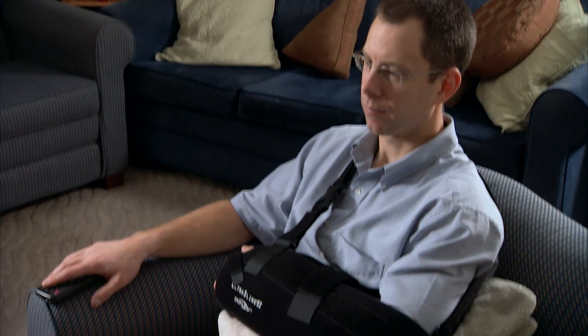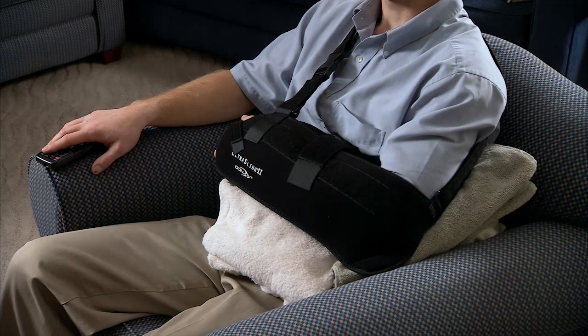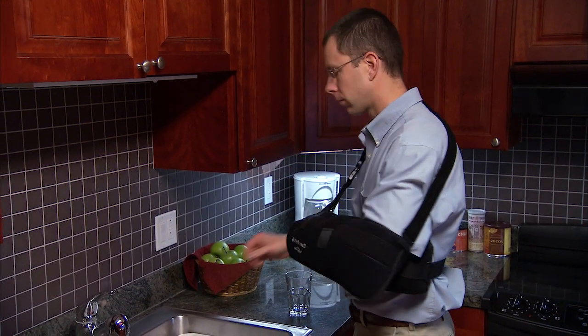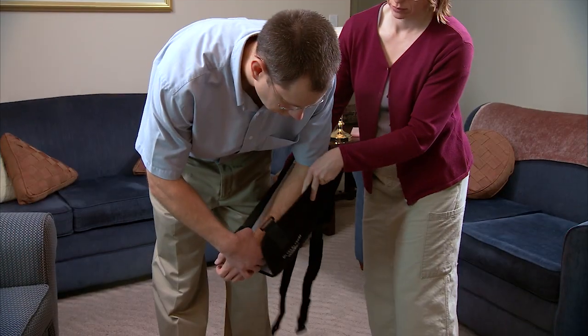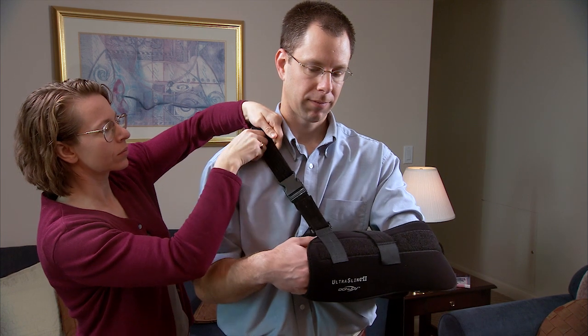As your shoulder heals, you will need to wear a shoulder abduction sling to support and protect it. Abduction refers to moving your arm away from the side of your body, movement that puts stress on your shoulder. The sling is designed to prevent this movement. You will need help putting the sling on and taking it off. Be sure your health care team has shown you and your caregiver how to do this.